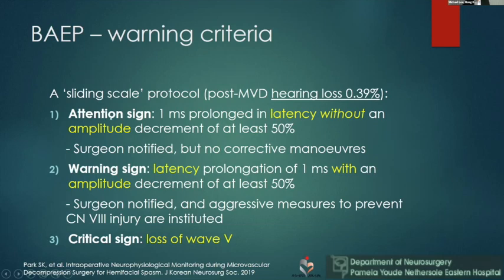One is the attention sign, that is the change in latency without change in amplitude. Then surgeons are notified, but no corrective maneuvers. If you have change in latency with change in amplitude, it's called a warning sign, and the surgeons will be notified, and you have to take aggressive measures to try to see whether this change can be reversed. If it's just a transient change, then probably it will not cause any problem. If you have total loss of wave 5, then it's a critical sign, and it's very bad.